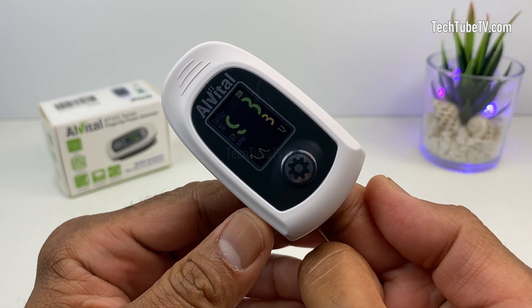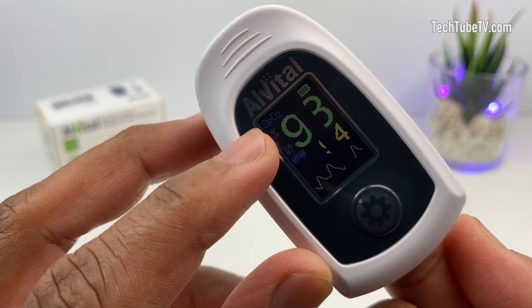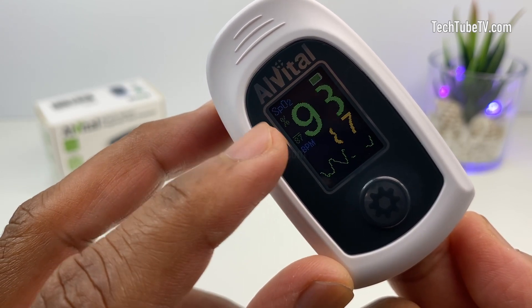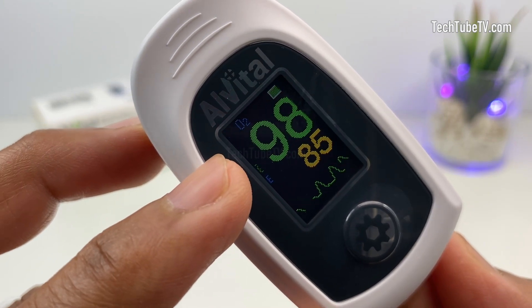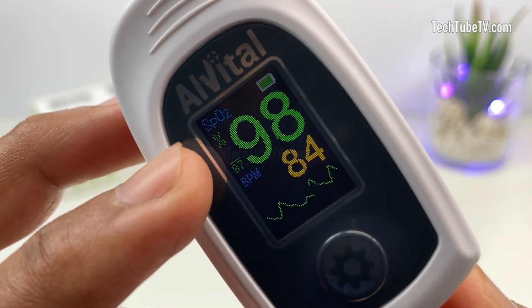Wait for a few seconds and the readings will be displayed. There are two different readings shown: this is the oxygen saturation percentage of blood, SpO2, and this is the pulse rate. Ideal pulse oximeter readings are oxygen saturation levels of 95% to 100%, which is considered normal. Values under 95% are considered low. This shows that I have a healthy blood oxygen level.